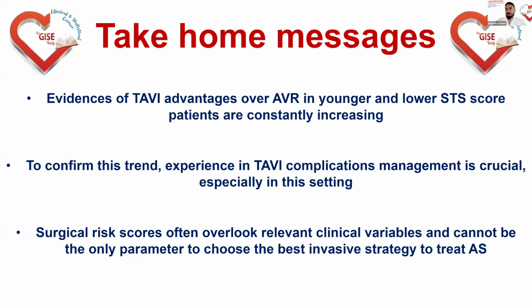And the inflation volume was nominal in this case, so we did not even overinflate the valve. And another interesting thing that I forgot to show was that we performed valvuloplasty before, and the valvuloplasty balloon did not burst. So this is another interesting thing.